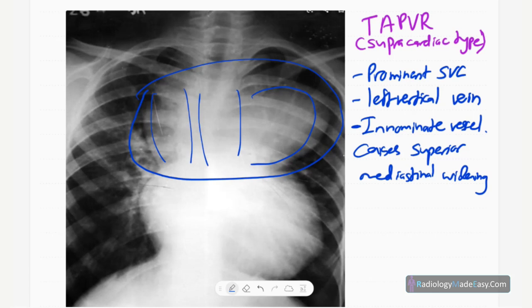Next is the boot-shaped heart, seen in tetralogy of Fallot. Tetralogy of Fallot has four features: obstruction of the right ventricular outflow tract, right ventricular hypertrophy, overriding aorta, and VSD. The boot shape is due to an upturned cardiac apex caused by right ventricular hypertrophy, combined with a concave main pulmonary artery shadow.